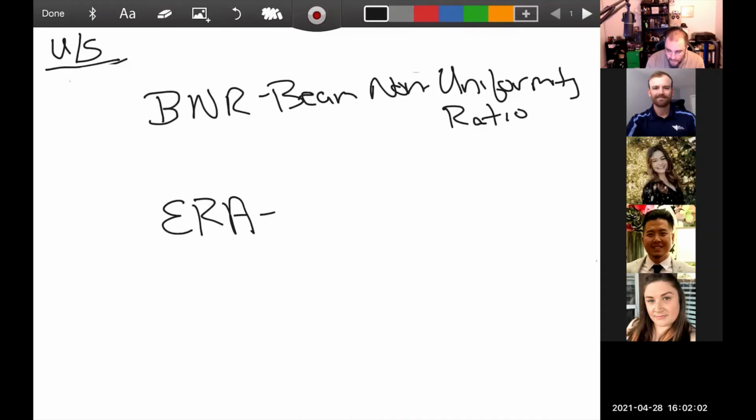Does anyone remember what ERA means? Effective radiating area? Yeah, effective radiating area.